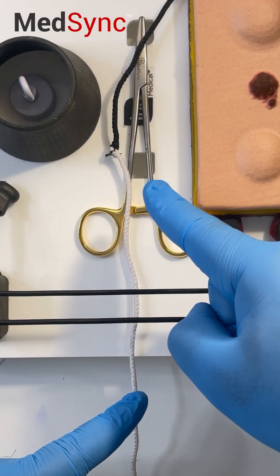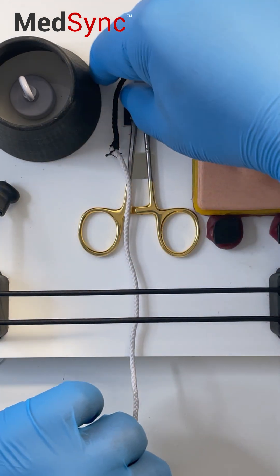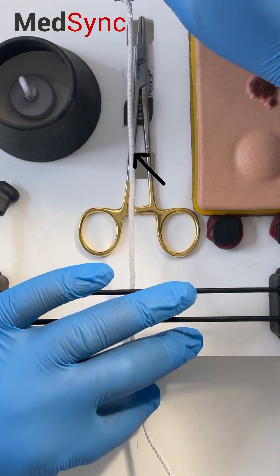Hand ties. This is an essential skill for all surgeons. You start with a short end and a long end.